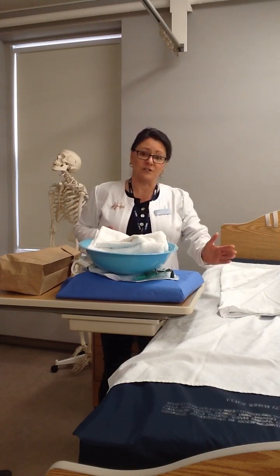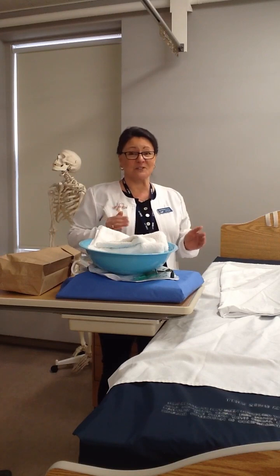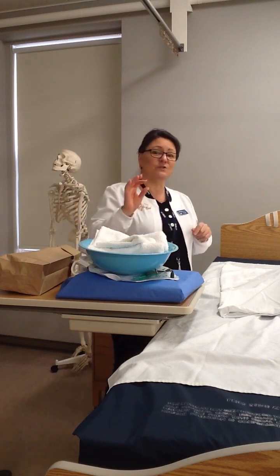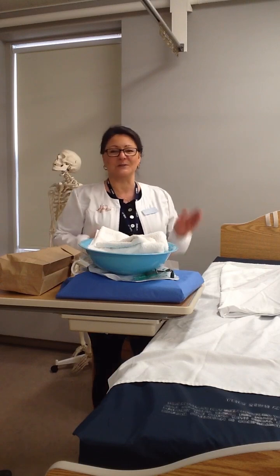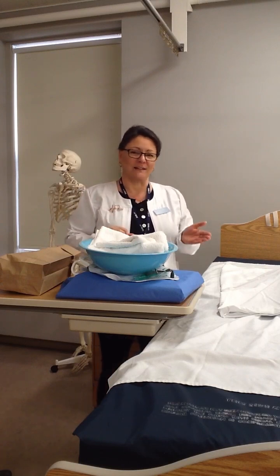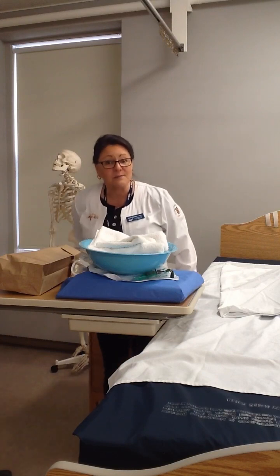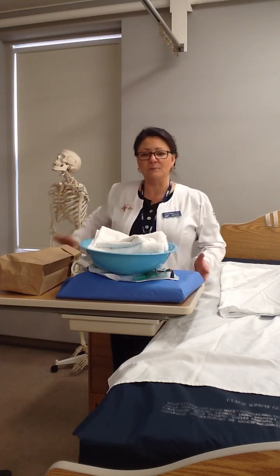We care for our patient from the right-hand side of the patient. So even if you're a left-handed person, as you've heard me say in some of the other videos, you can still do this. If you are a left-handed person, you can still insert a catheter with your right hand. I will show you how you can do that when we get practicing in the lab. And so I've got a table behind me. That's important too to my triangle, because as I'm done with items, I'm going to move them behind me.